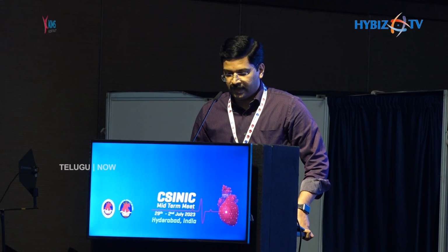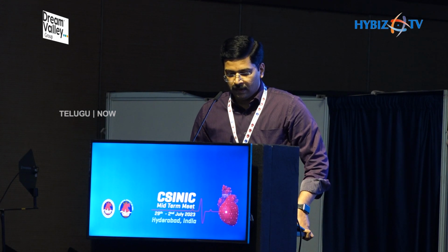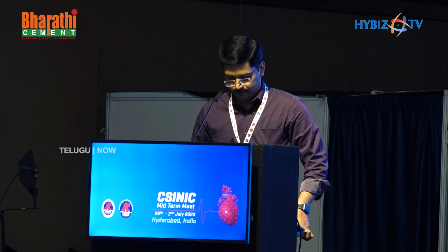From the LCX, the IVUS run showed the distal LCX stent edge was showing no dissection. The ostial LCX was measuring 5.71 millimeter square, and there was an area of malapposition in between, which we corrected with an NC balloon. This is the final result. The patient did not have any symptoms during the procedure, no ECG changes. Serial echo during and post-procedure showed no effusion, and serial creatinine values ranged from 1.6 to 1.7 during hospital stay, post-discharge, and at 1 month of follow-up.